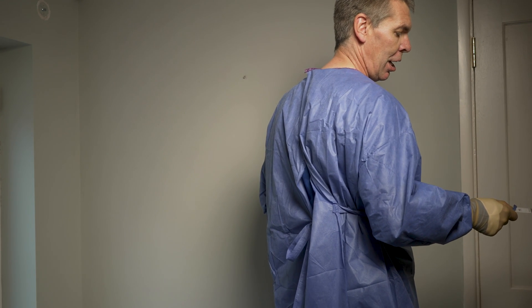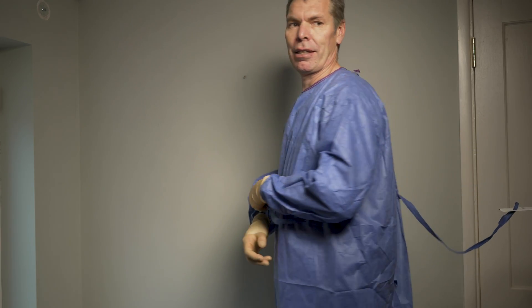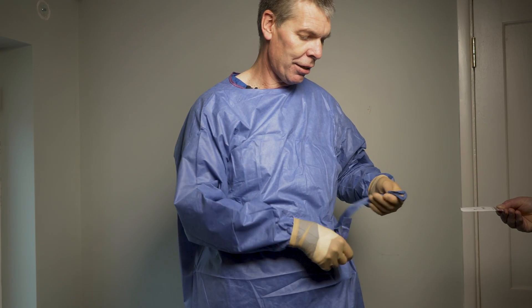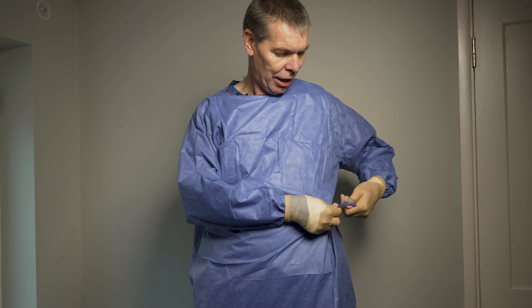We have the gown, and the final step is to tie the front ties. There are two ties joined by a piece of card — the left tie and the right tie. I keep the left tie in my hand and hold the right tie with the card. I pass the card to an assistant who holds it while I spin until the tie is almost in front of me. My assistant keeps hold of the card while I take the tie and tie both ties aseptically at the side. I'm now gloved and gowned, ready for surgery — hands clasped in front above the waist — and ready to move into the operating room.